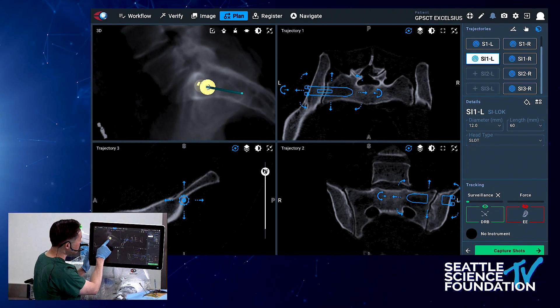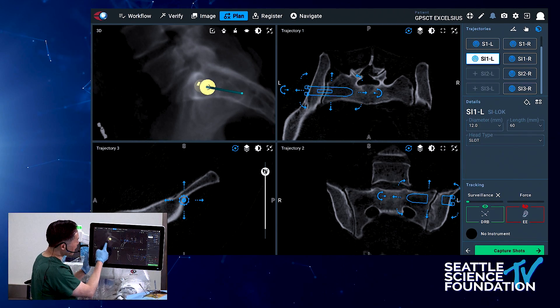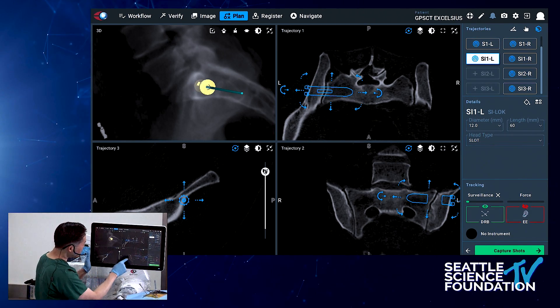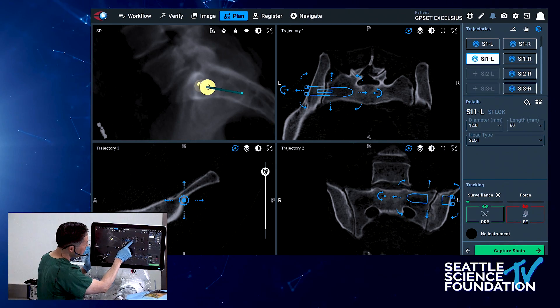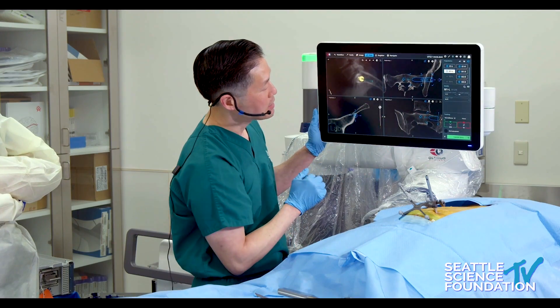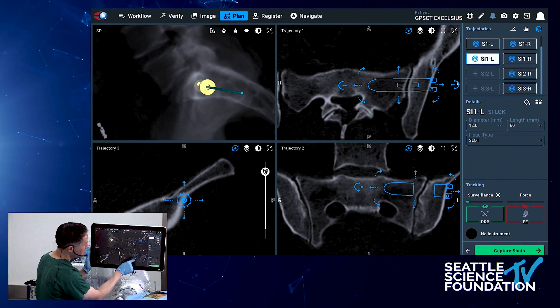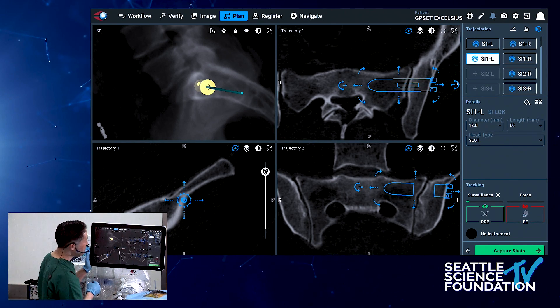My first screw plan has a trajectory towards the SI joint. That cortical line represents the ventral pelvis — you do not want to be above that. This initial screw is placed on the upper sacrum. You can see the ileum sacral joint and then the sacrum. It's a 12-millimeter diameter screw, and the implant has a hollow center where bone graft will be placed, crossing the SI joint.